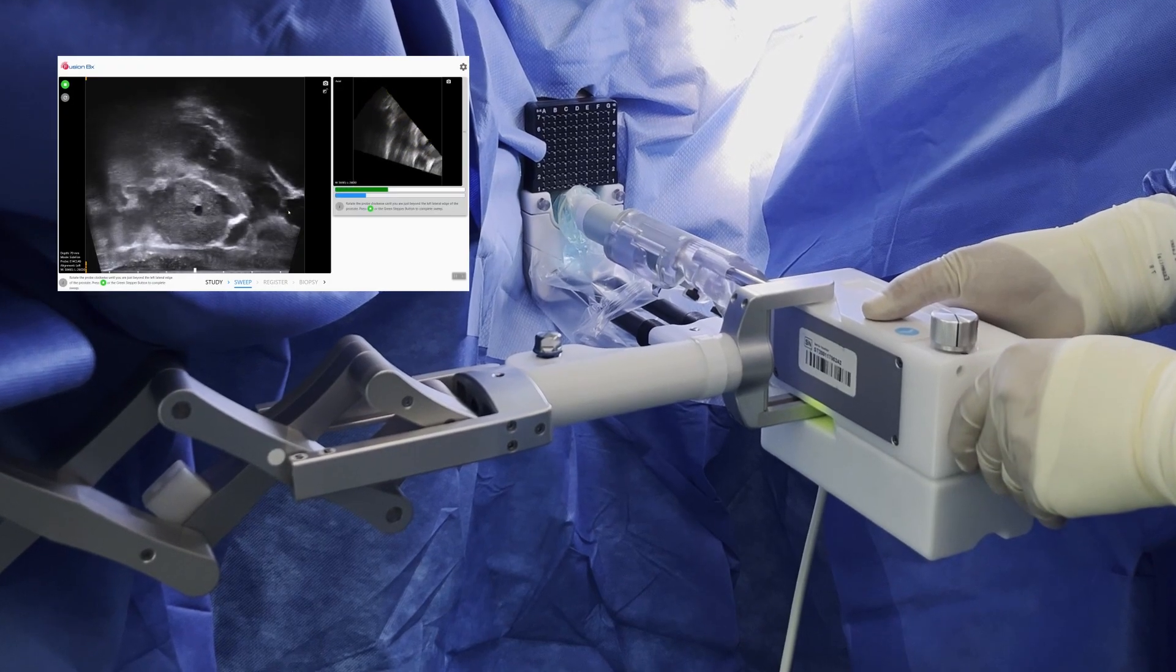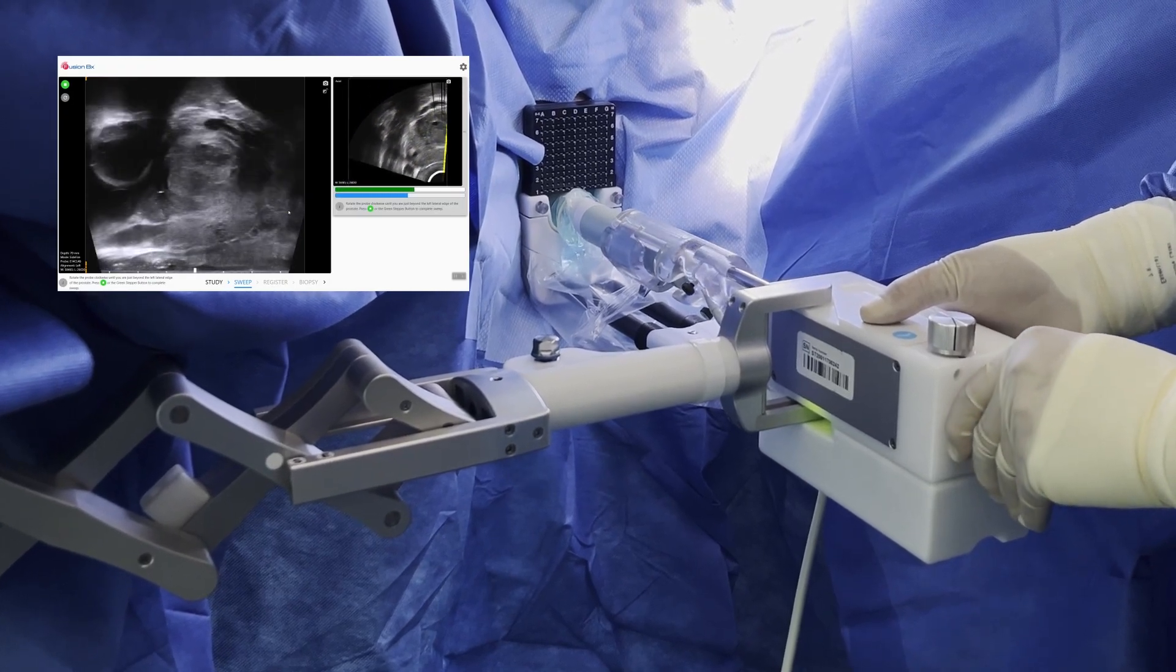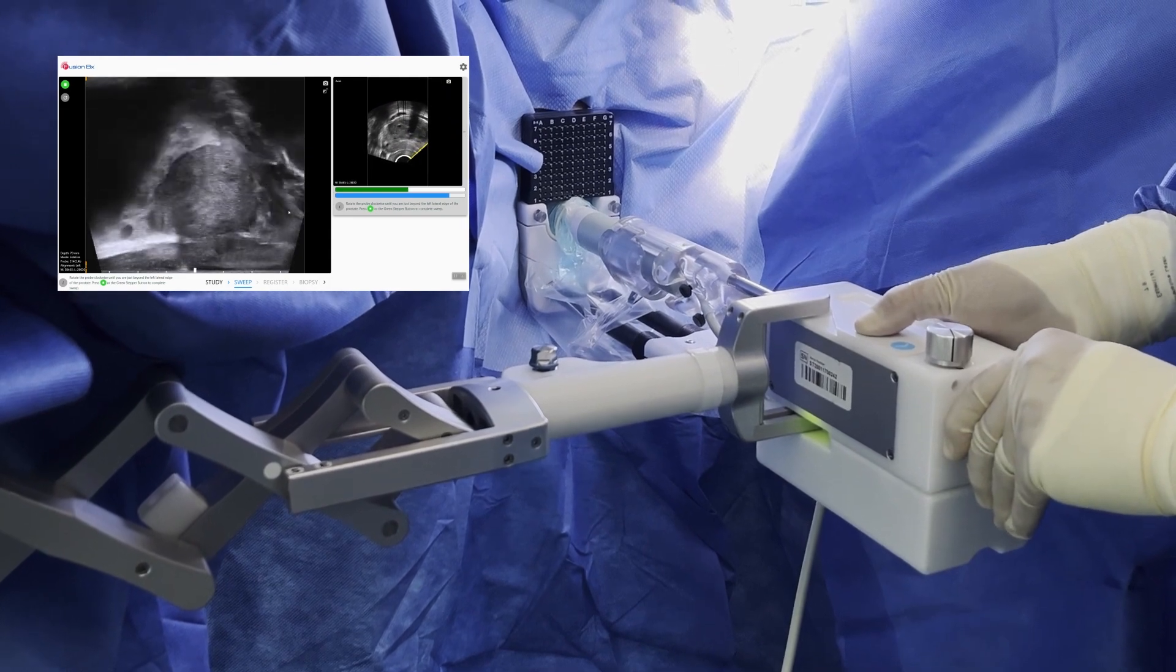The counterbalance semi-robotic arm replaces the traditional stepper, making it easy to position the probe and track its movements.